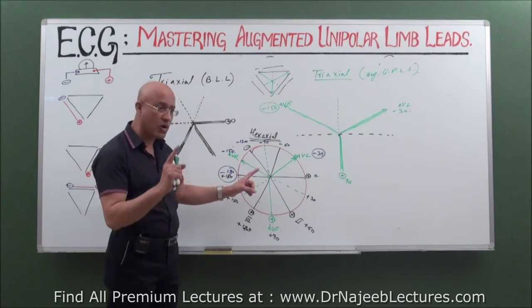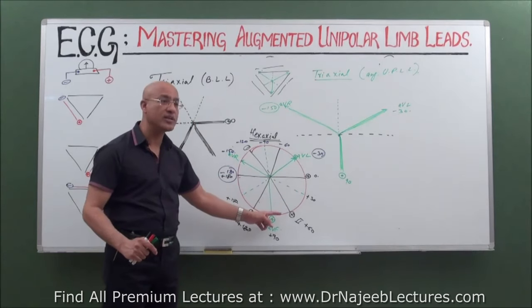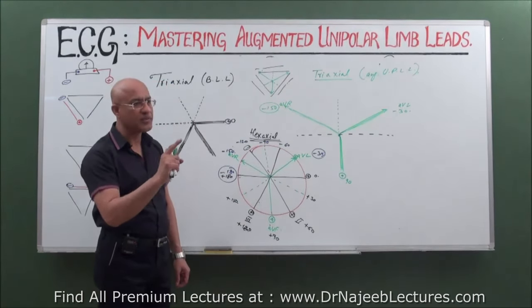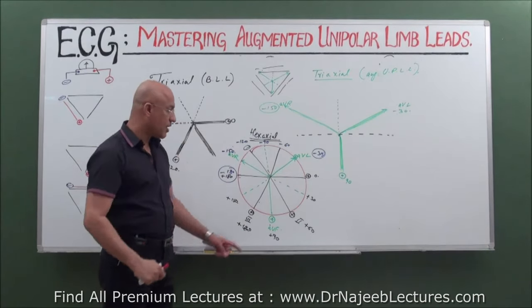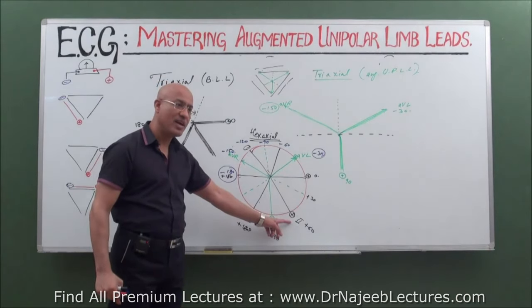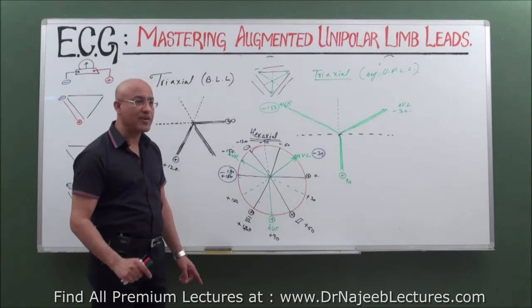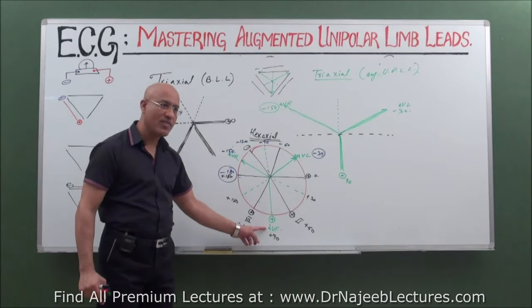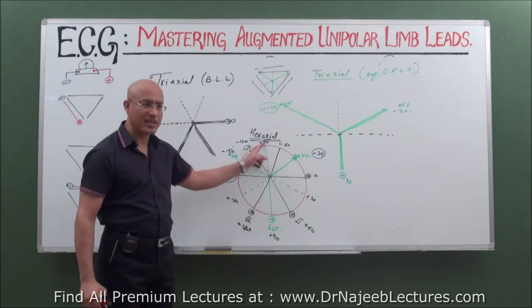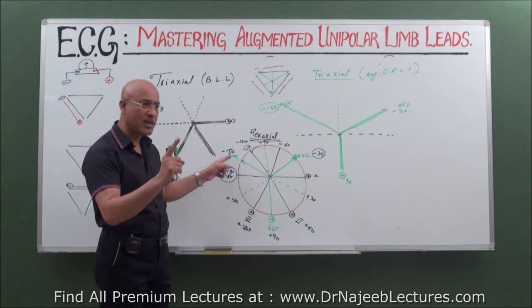But one thing I want you to remember is that as far as these leads are concerned, you must know their orientation and you must know their polarity. For example, if I say bipolar lead 2, orientation is plus 60 degree and polarity is down and left. If I say AVF, orientation is 90 degree and the exploring electrode is at plus 90, not at negative 90. If I say AVR, you should be able to tell immediately: AVR has positive polarity where?